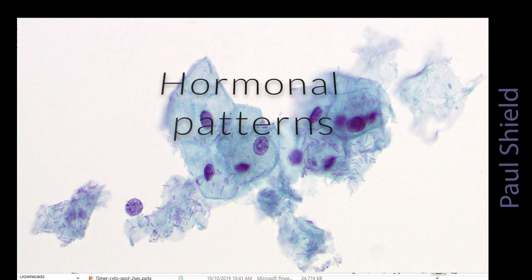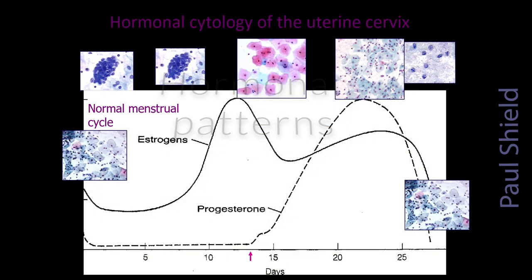Paul. In this clip we're going to look at the different patterns that you see in the cell sample at different times of the menstrual cycle and different times throughout life.